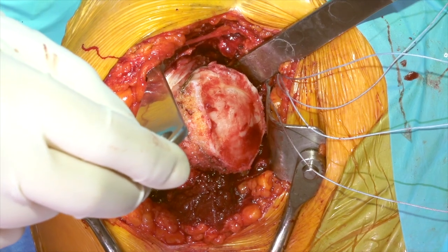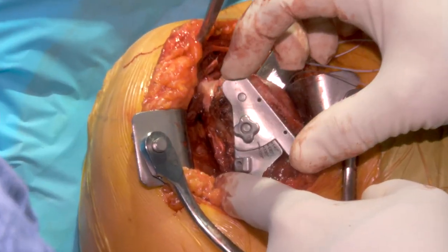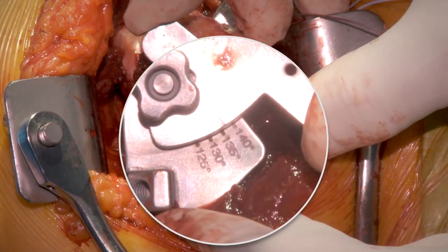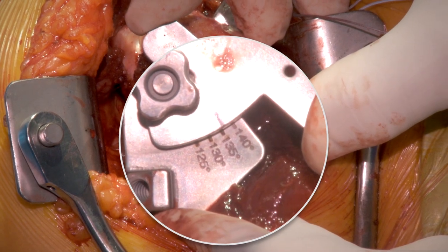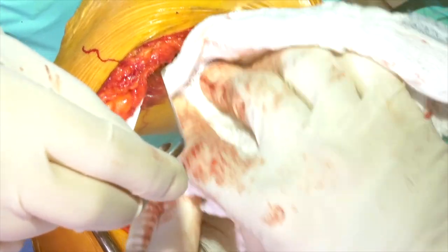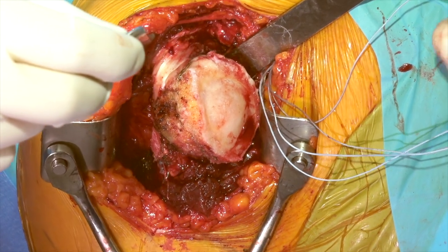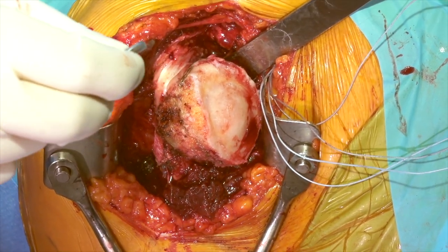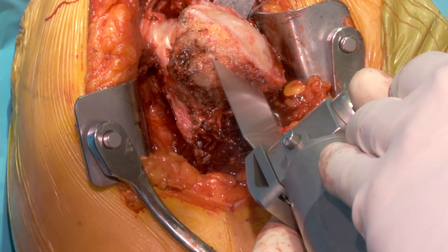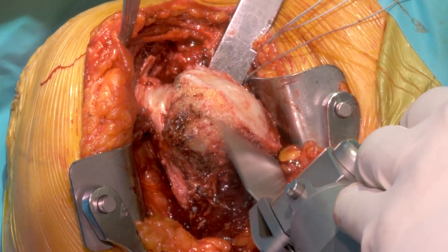With the extramedullary base guide, if you can see the humerus well, you can dial this into the position you'd like. It allows you to put two pins across and then put a cutting surface. Here we see about a 135-degree inclination cut, which looks pretty good for this patient. Most of the time I do this by freehand, so we'll place our saw on our proposed cut and make our resection, making sure we can identify where the rotator cuff is proximally.